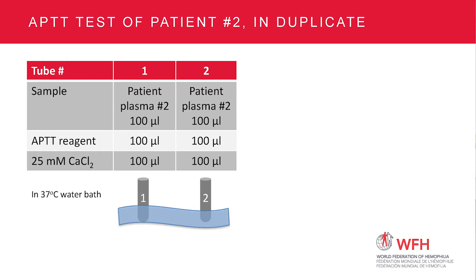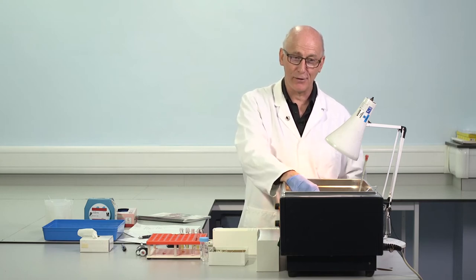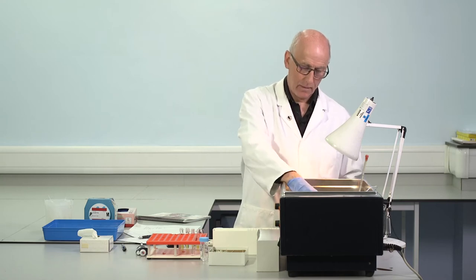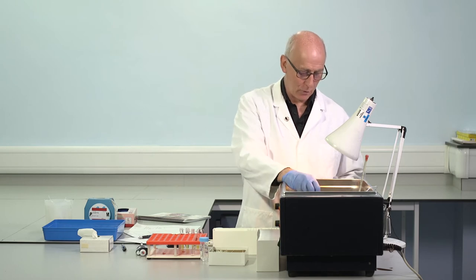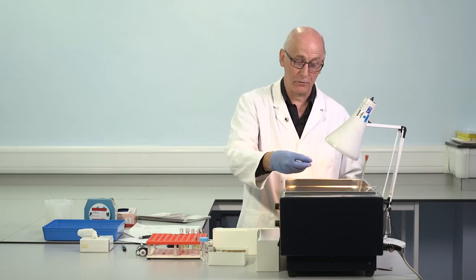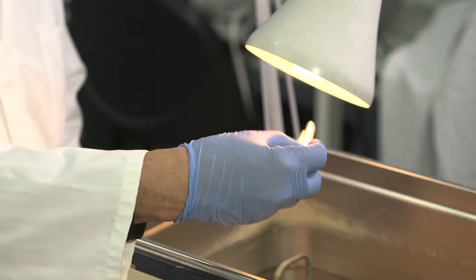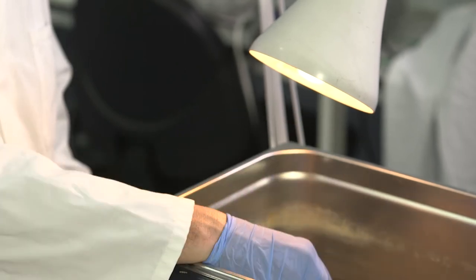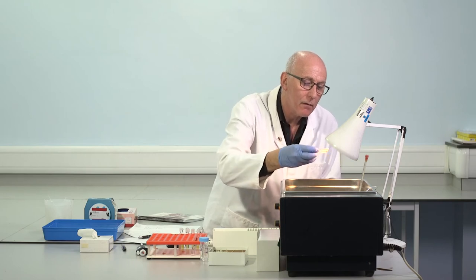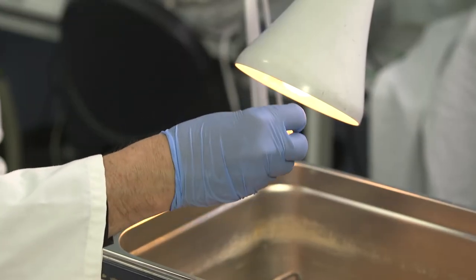Okay, so we've added the calcium. Tilting the tubes, 3 times, 5 seconds, 90 degrees. If you go above 90 degrees, it tips out. Okay, but I can see the watch, you can't. So I'm already up to 50, 55 seconds. So much longer than the control, prolonging. So we're already expecting to see an abnormal result. And I mentioned, I think, that the endpoint is weaker when the clotting time is longer. This is a much longer clotting time, as you can see.